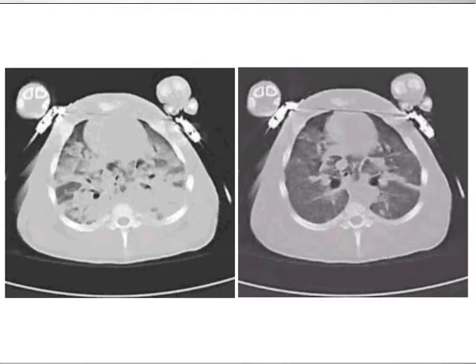VTCO2 compensated for or corrected for the tidal volume seems to decrease when overdistension increases. The pattern is not as clear as when using dynamic compliance together with collapse. The blood pressure also seems in these circumstances to go down, but it's fairly small numbers and difficult to detect when you do the recruitment maneuver.